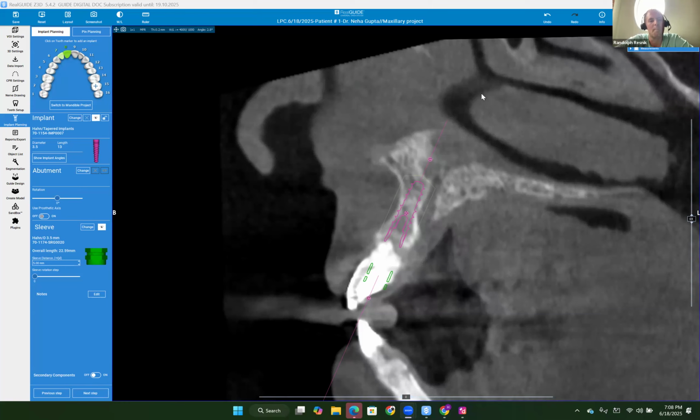Now, in terms of building the papilla up, I would do that when you're going to place the implants and put them in healing abutments and even put them in temporary restoration. No matter what interim prosthesis you're going to have, you're going to lose the papilla between 7 and 8 there. So when you do place the implants, one, you can use custom healing abutments. So if you're going to do this case guided, ITX can actually make you custom healing abutments that will engage the implant based on your CBCT plan that will have contours of what the prosthetic would be.